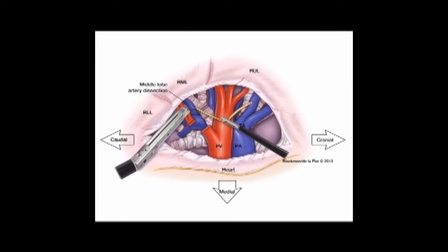Once the bronchus has been divided, you can encircle, staple, and divide the right middle lobe pulmonary artery. Once that vessel branch has been divided, all you have to do is dissect the fissure and staple and divide it, completing a right middle lobectomy. Once the right middle lobectomy has been performed, you can place the right middle lobe into an endocatch bag and remove it through the utility port.